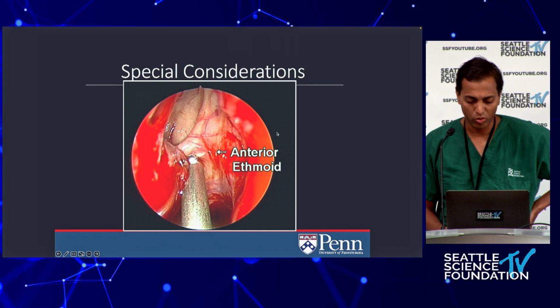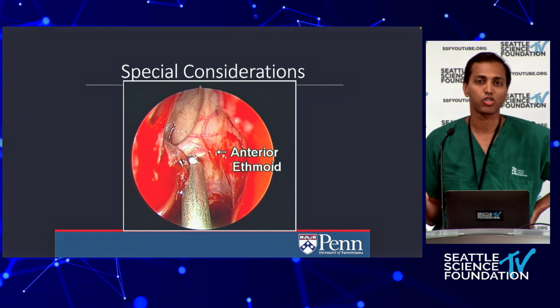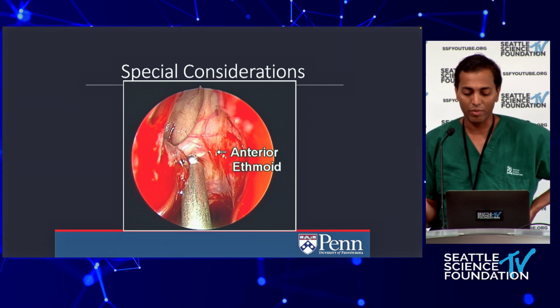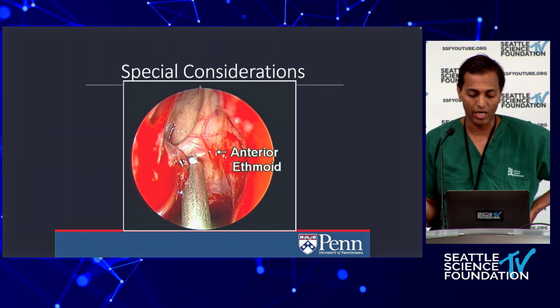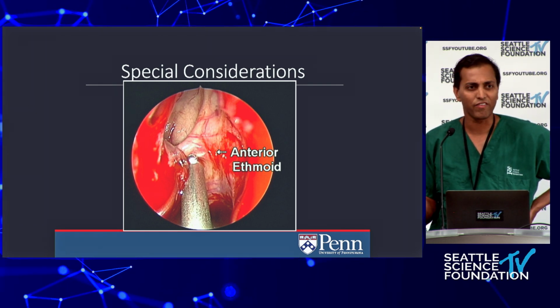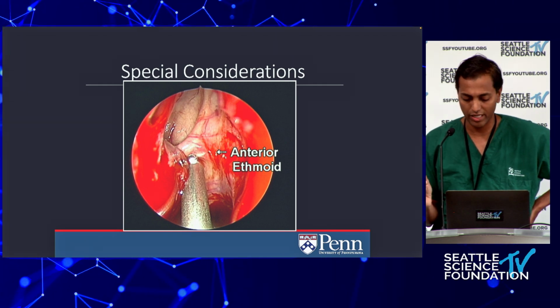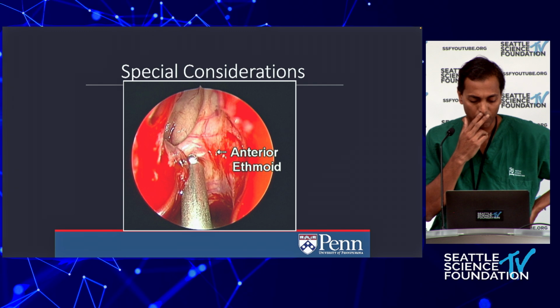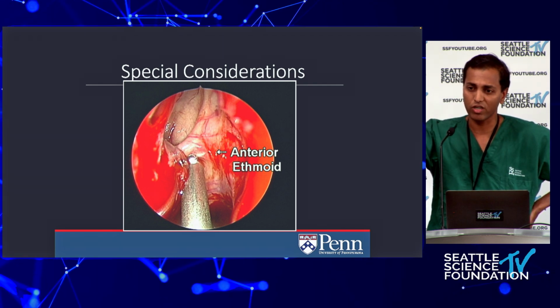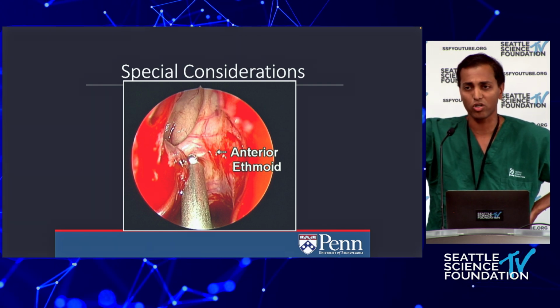And then we talked about anterior ethmoid arteries. Like I said, I'm not going to say too much about them, but for all your dissections in the lab today, make sure you find that vessel and get a good feel for where that is. While it's not exactly constant, there are some constants about that vessel. I think Arya actually mentioned that we were talking about that horseshoe shape. It is pretty classic that you've got that frontal sinus recess pathway, then there's typically one cell, and then you're going to see that anterior ethmoid artery right there.